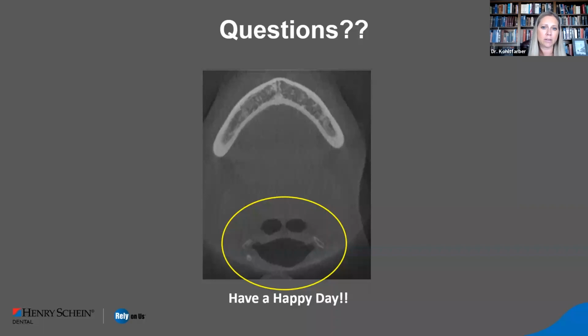They're using automatic nerve mapping software, which is probably looking at the various gray levels to be able to automatically map something. In that case, that may not be exactly accurate, especially of a patient that has osteoporotic changes and that sort of thing. Because if you have an automatic segmentation tool of any kind, whether you're doing the airway or the mandibular canal, all it's looking for is a certain gray level to try to automatically include that in its segmentation. And so that can definitely be wildly off.